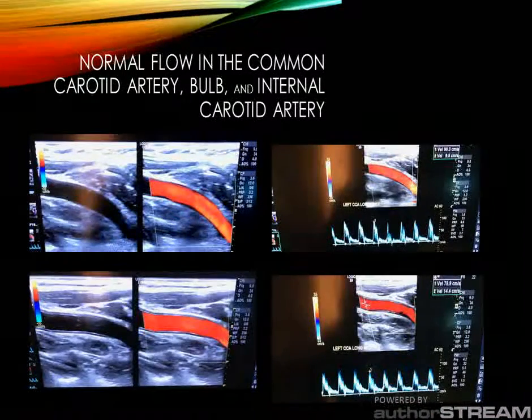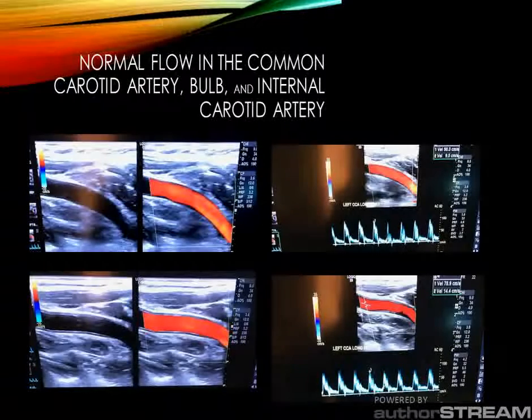Here we are looking at normal laminar flow within the common carotid artery. The laminar flow shows consistent color flow through the vessel because all flow is in line with each other. Remember to take velocity samples in the center of the vessel because with laminar flow, the blood in the center of the vessel is moving the fastest due to less resistance.